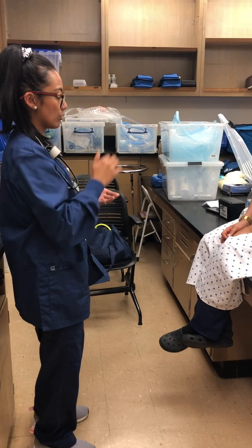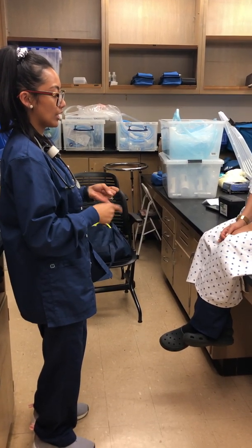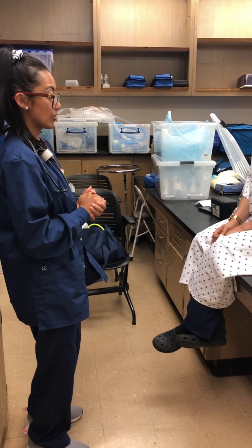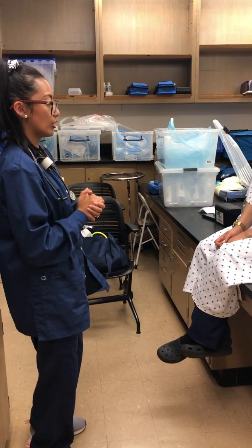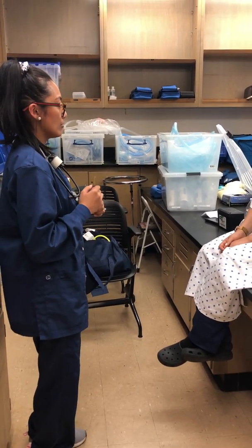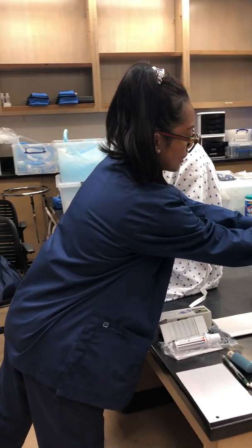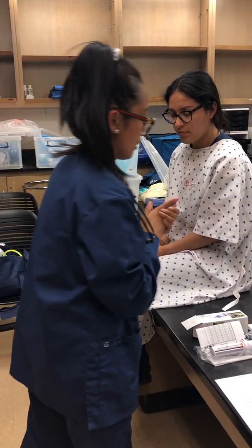So today I will be doing a little respiratory assessment. I will need to gather some vitals, listen to your lungs, and to see if you need an albuterol administered to you to help with your breathing. Because I know in your medical records it does mention that you do have a little bit of asthma. Okay, sounds good? Okay, so at this point I would sanitize my hands once again with at least 3 ml. And then putting on the gloves.